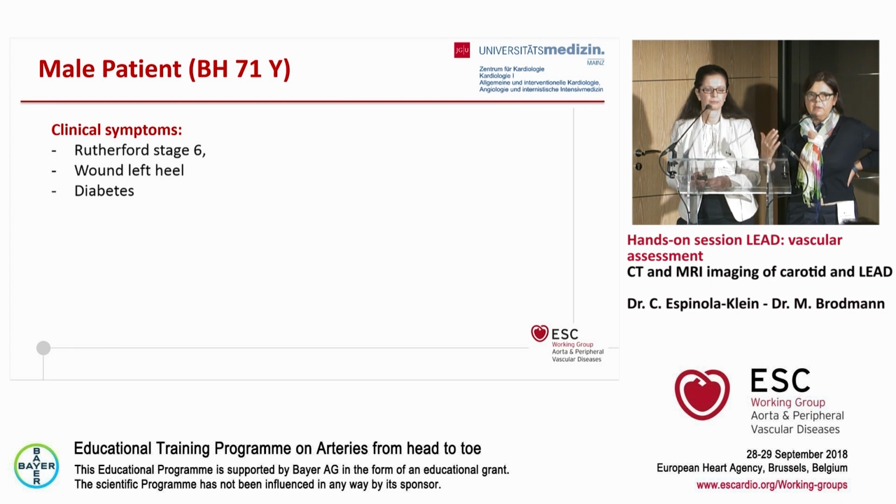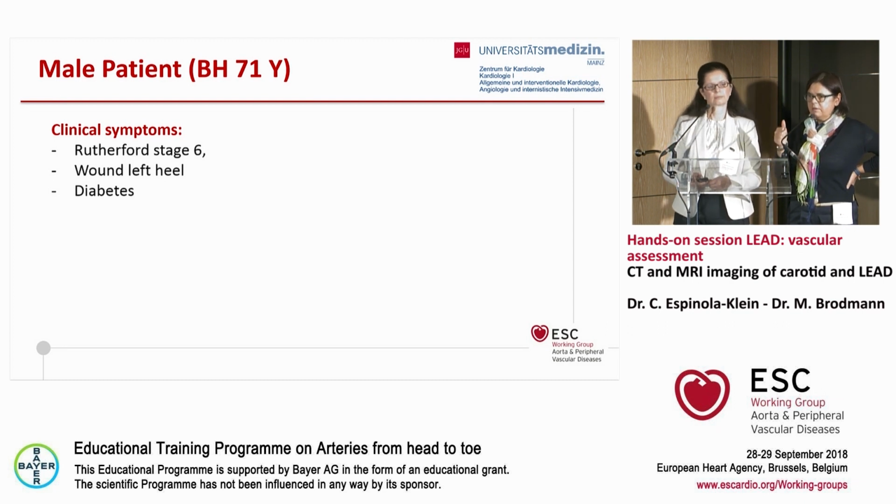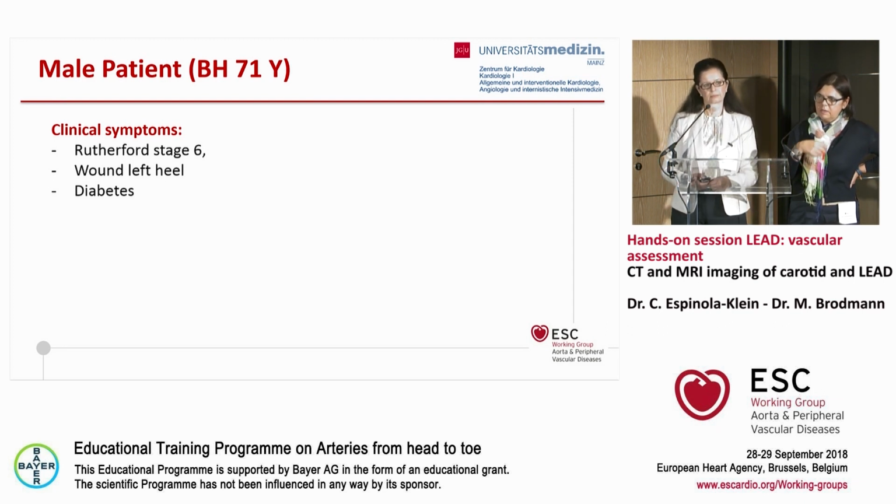So you have different ways of looking at it, and I would not underestimate, once again, the primary screening tool, which is ultrasound. The primary screening tool is ultrasound. So if you go down there and see all this calcification, and then you do the additional imaging.